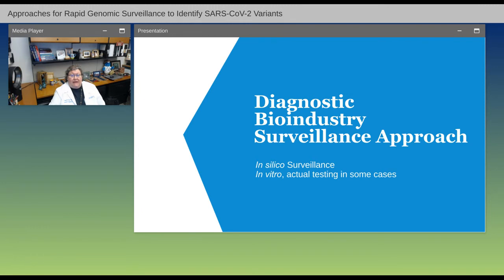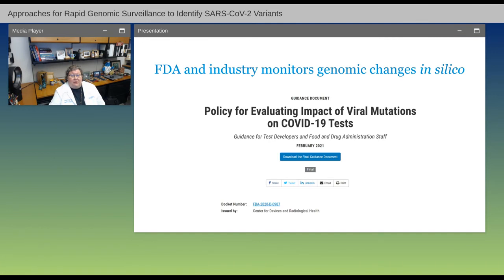So what is the diagnostic and bioindustry surveillance approach? Many companies and many laboratories do both in silico and in vitro work. The FDA also monitors the genomic changes in silico, and this is their website for evaluating the viral mutations and the impact on COVID tests. I would check in with this often, because if there are other variants that impact your test, they will be posted here.